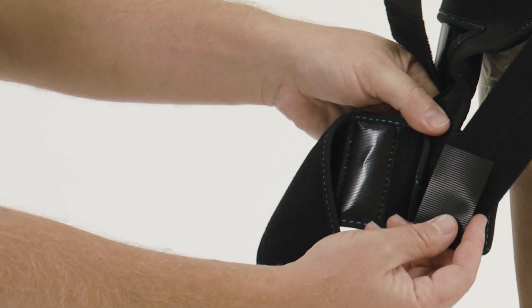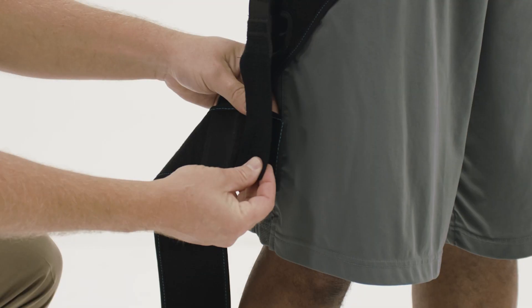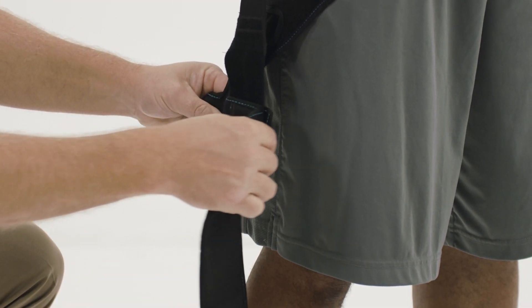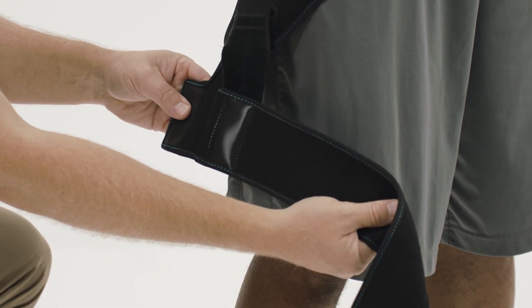Place the velcro strap holder on top of the wide strap end. If using a rotation strap, apply the rotation strap back on top of the velcro strap holder. Fold the T-strap forward and over both straps, velcroing securely. Follow the same fitting process as mentioned previously in this video.